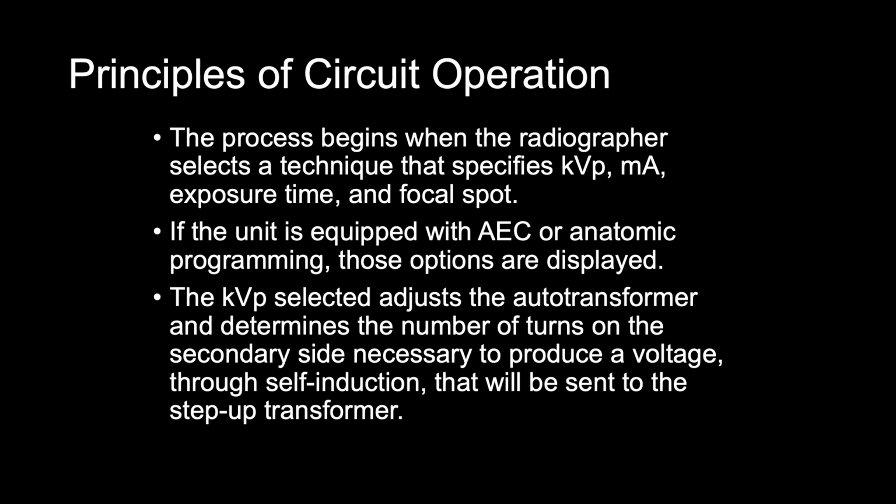So now we are going to walk through the X-ray circuit's operation from the incoming power to the X-ray tube. The appropriate place to begin is the actual operating console. This is the first place that the RT is going to be setting their technical factors. Like the controls of an automobile, there are options and arrangements, but all have the basic options in common.